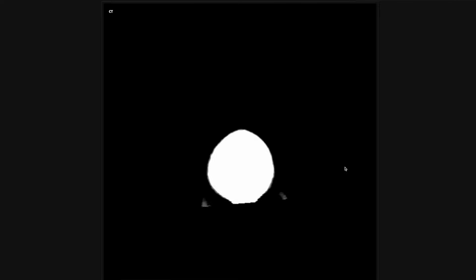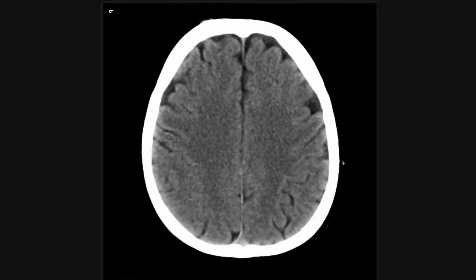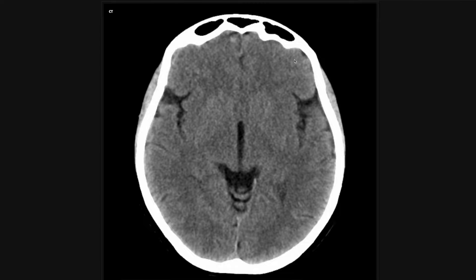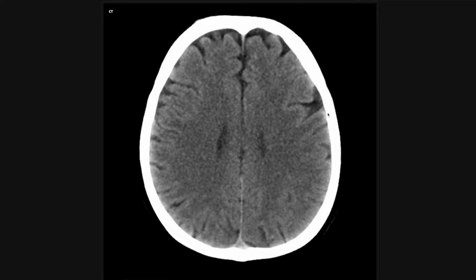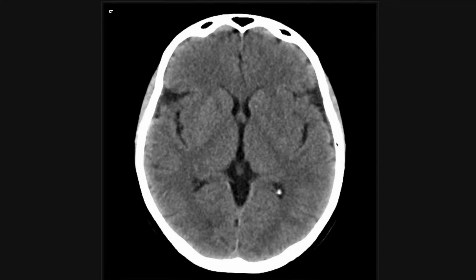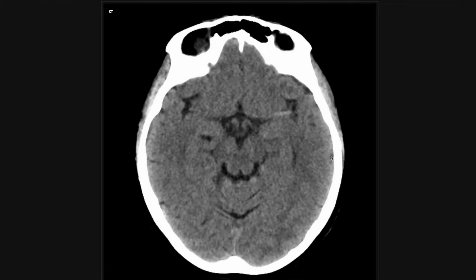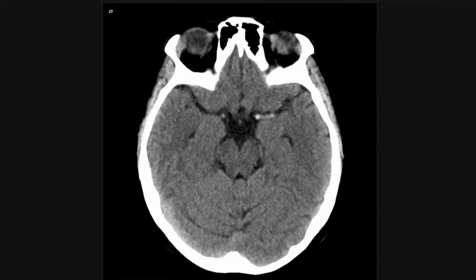I don't see any changes in the cortex or the gray-white differentiation, which I'll get to later. Basically, you should be able to see a difference between the cortex and the subcortical white matter — the darker stuff is the white matter, the cortex is brighter. If you start to see blurring there, you're worried about an acute stroke. We'll see some cases of that later. In this case, I don't see that, but what I do see is this.